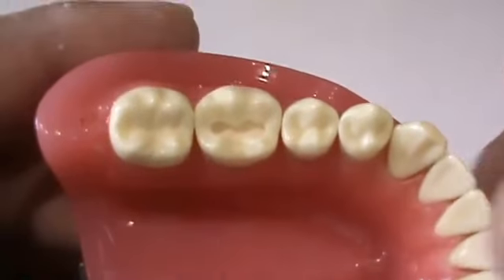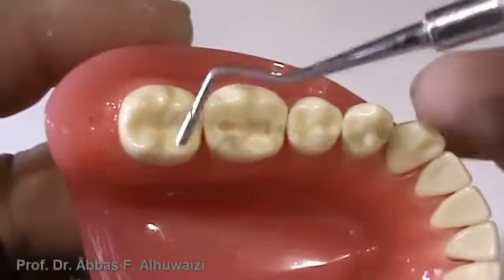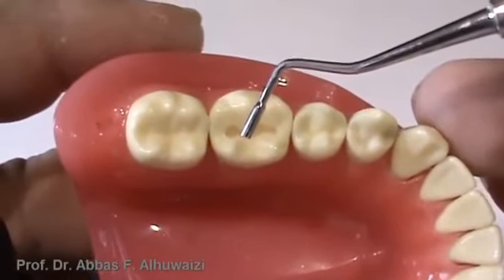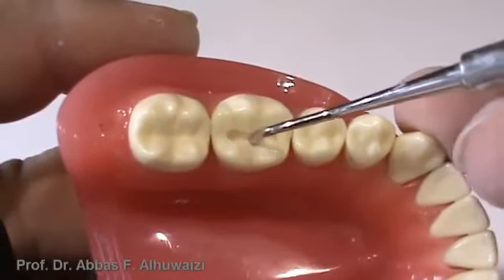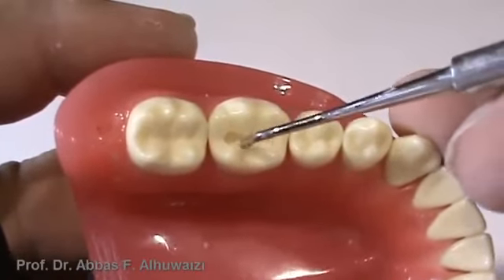This is to show the convenience form. When we bring a condenser, the smallest size condenser should just fit inside the cavity.